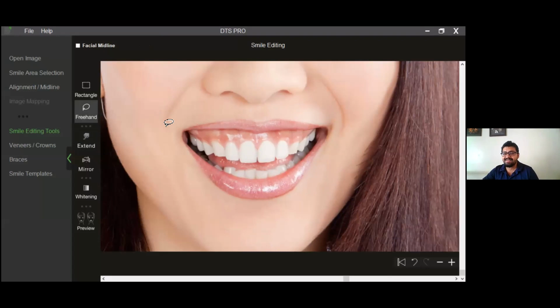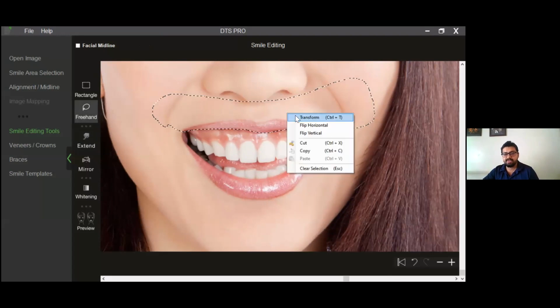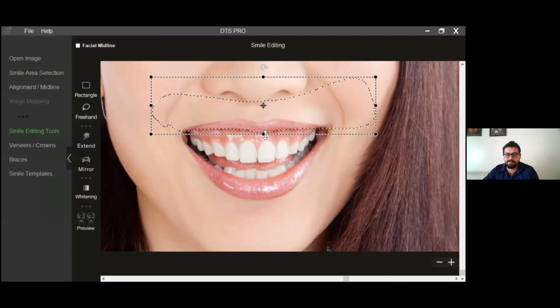going ahead with say a surgical intervention, you could probably do some amount of orthodontic intrusion, some amount of possibly gingivoplasty, and maybe a bit of lip repositioning procedure. So we have got all these planning tools which can be done.